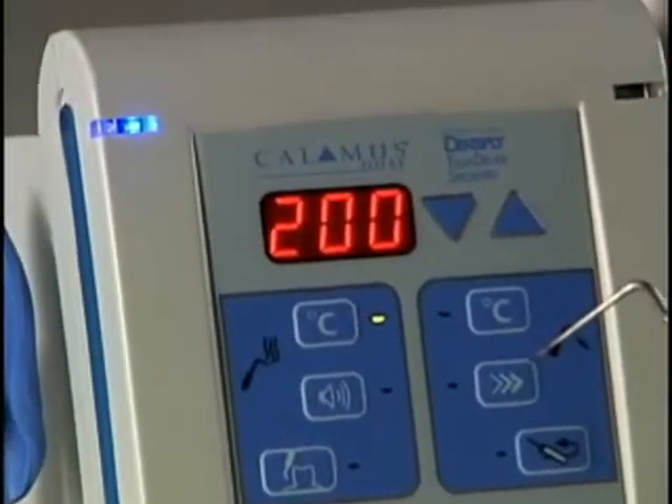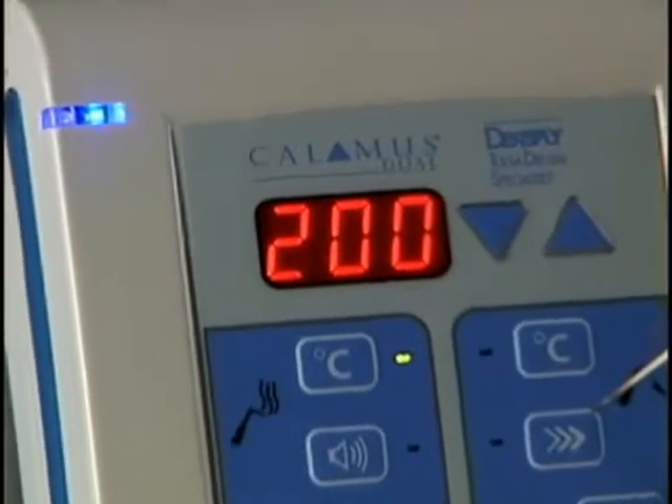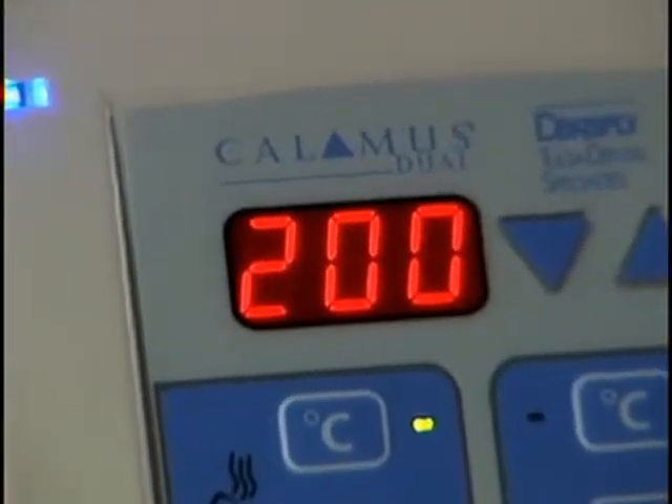If the temperature LED is illuminated, the selected temperature will display on the numerical LED window.